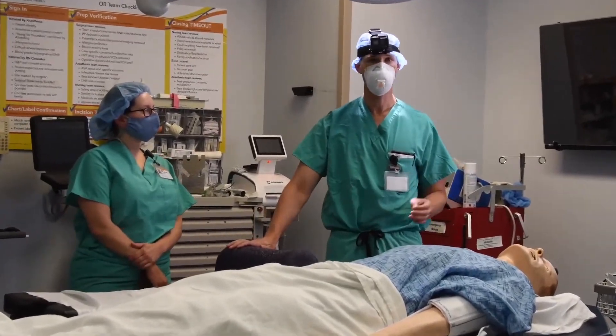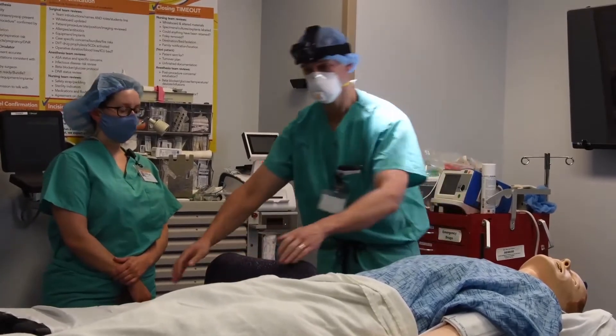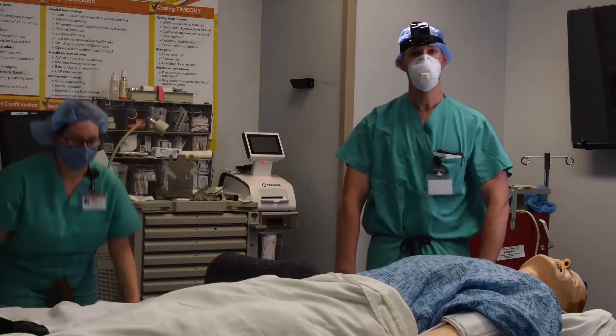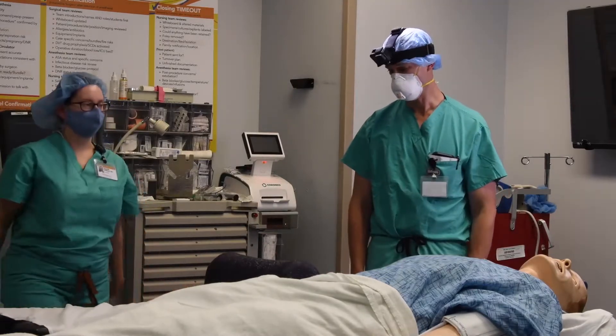Another thing to pay attention to before the patient gets in the room: you want a large sheet with plenty of slack on either end, and that'll be useful for cradling the arms as they're hanging below the patient.